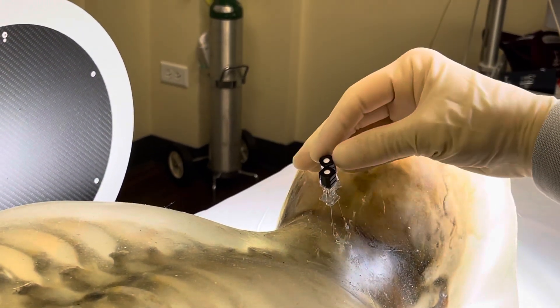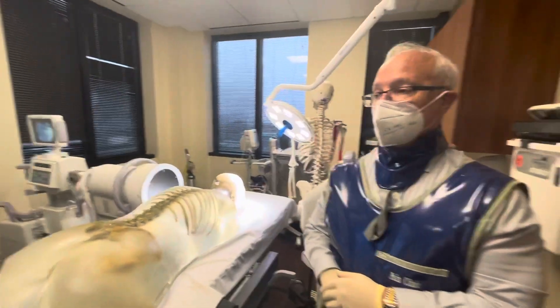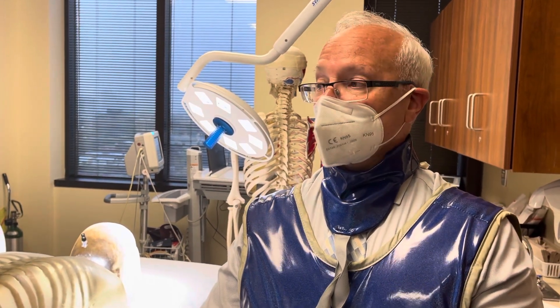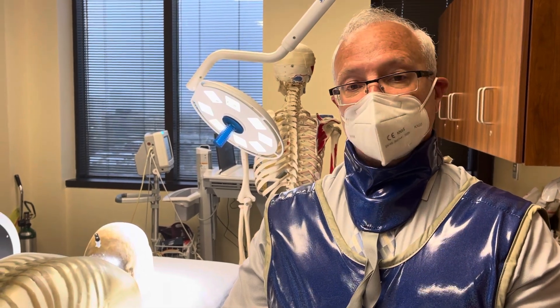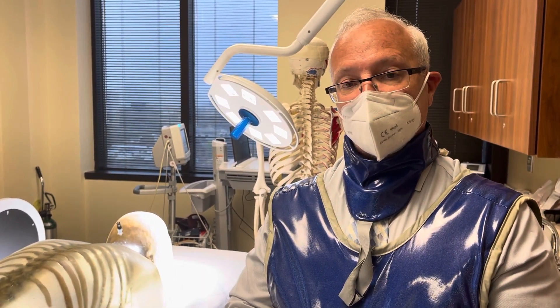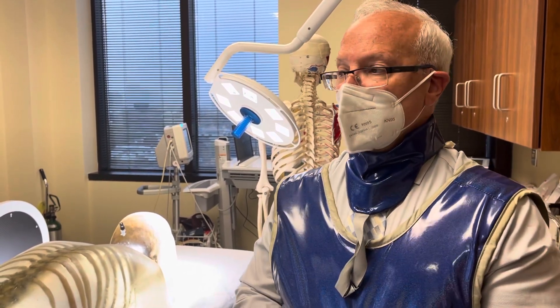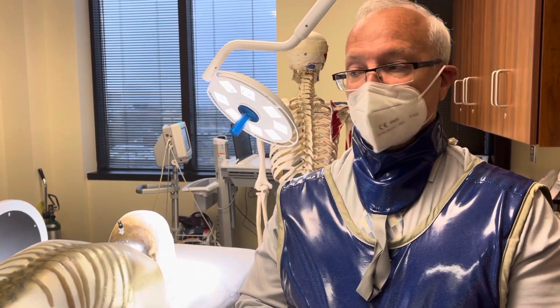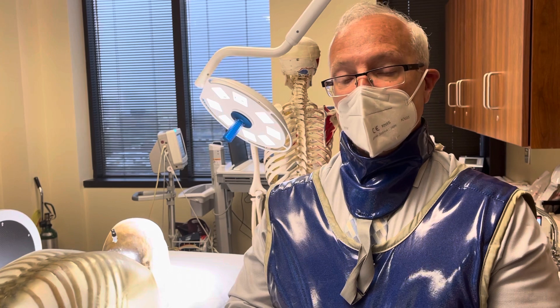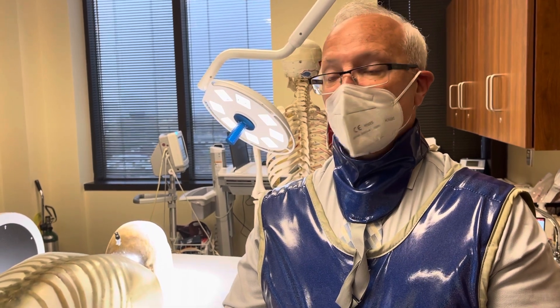We aspirate before we inject. I typically inject small aliquots — 0.5 mls of a non-ionic, water-based, soluble contrast agent. I look for containment of the spread and not vascular uptake. If that's successful, I inject a combination of a local anesthetic, typically bupivacaine plain 0.25%, with a non-particulate soluble steroid, typically dexamethasone sodium phosphate, preservative-free, approximately one to two milligrams. The total volume of injectate is about 0.5 to 0.7, and sometimes up to 1.0 mls. That is the technique of atlanto-occipital and atlanto-axial joint injections. Thank you for your time and attention.